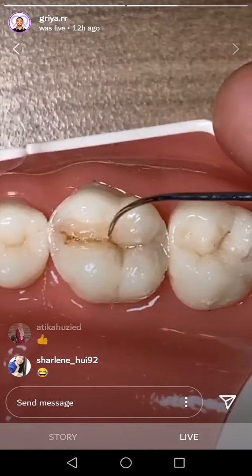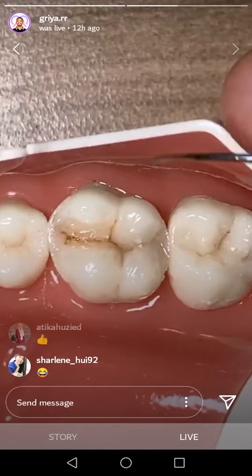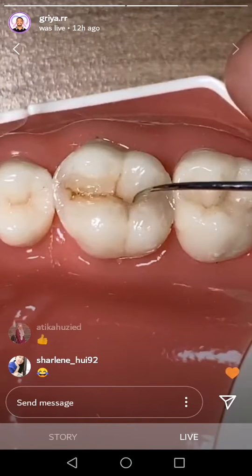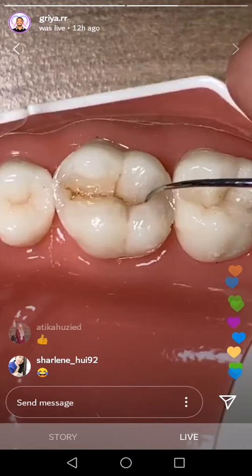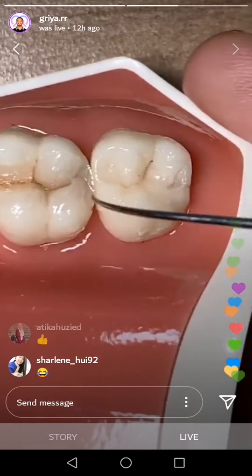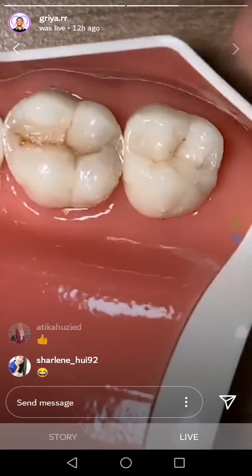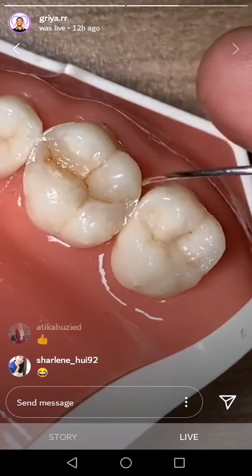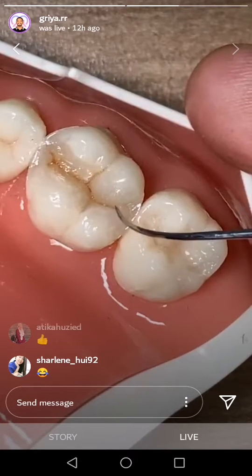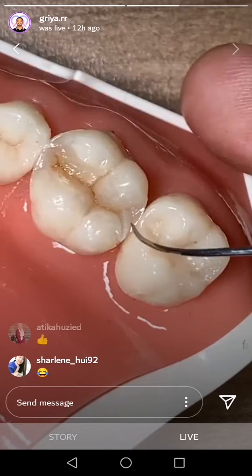Okay, and then follow the design. Be careful, in here they have a small cusp. Okay, so sometimes I do like this, to step like this. See, they have another cusp in here.